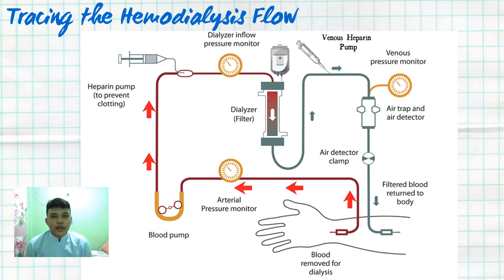After adjusting the blood pump, heparin will be injected, which is used to prevent the blood from clotting. It usually takes 3 to 6 hours per session. Also, a normal saline solution is administered to cleanse the blood of the patient.